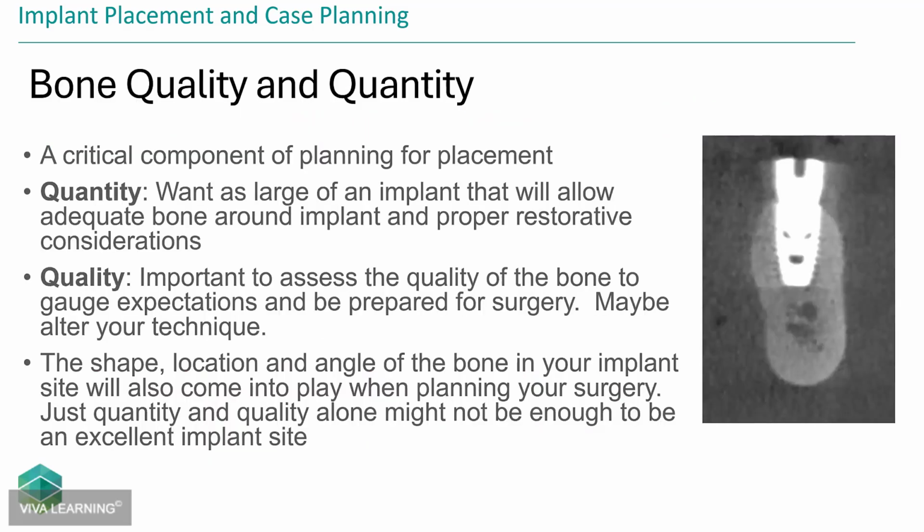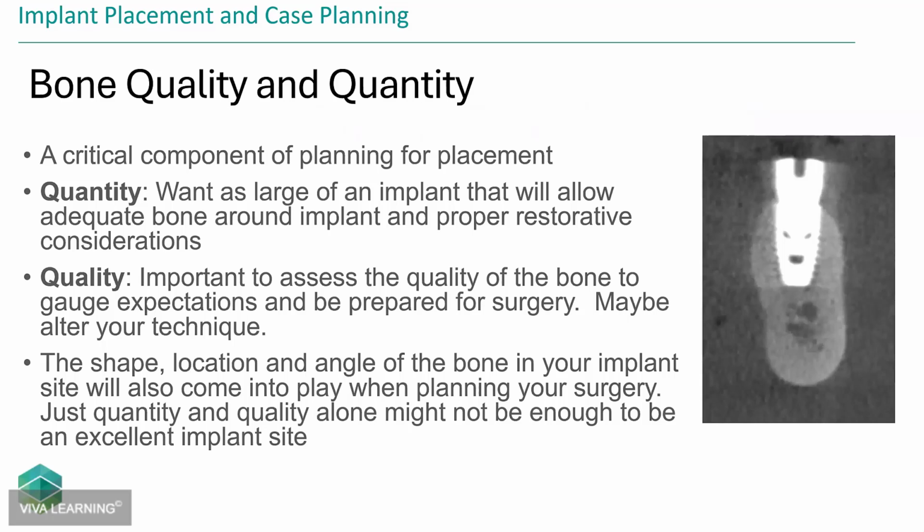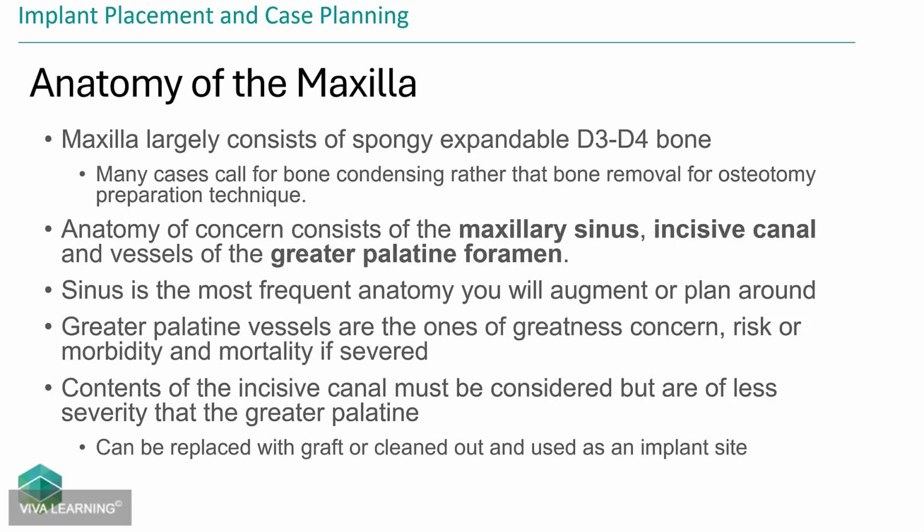So we did get an implant in there, but I can tell you that's the only good one we got into that site. I'm not thrilled about that case because I could not drill that bone big enough to get the implant I wanted in. And I think we left at least one of them about a millimeter supercrestal, and I couldn't back it out. So D1 bone is more the challenging bone, in my opinion.